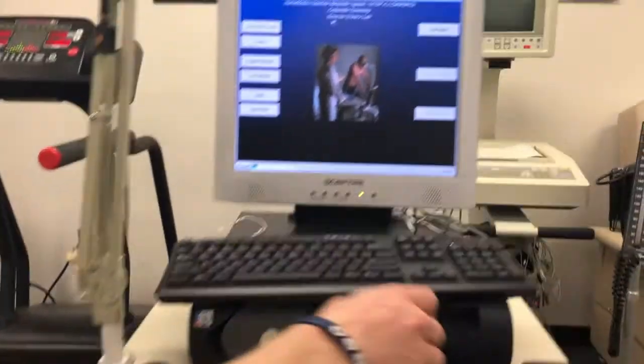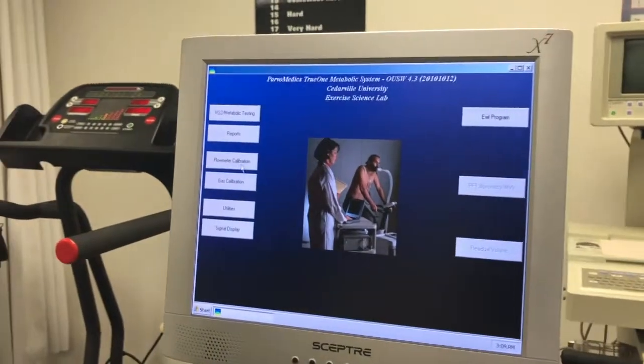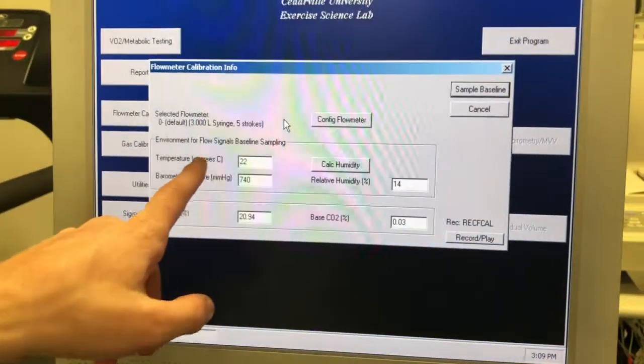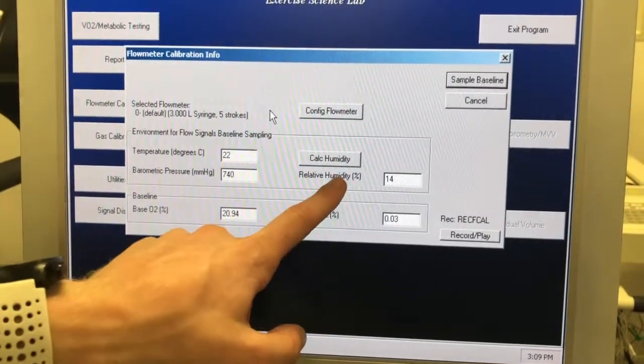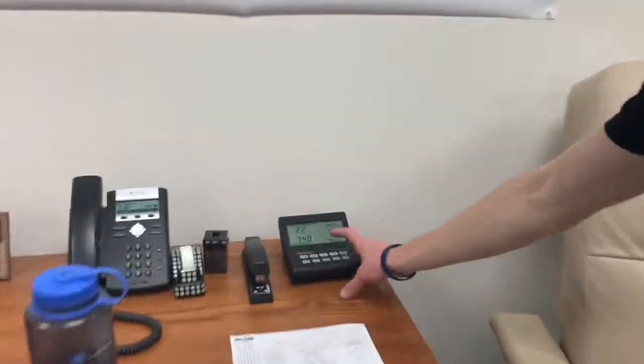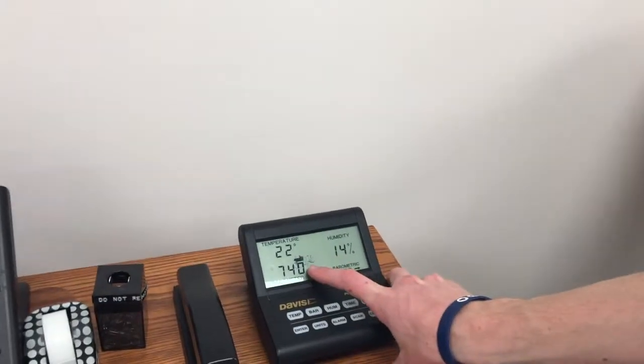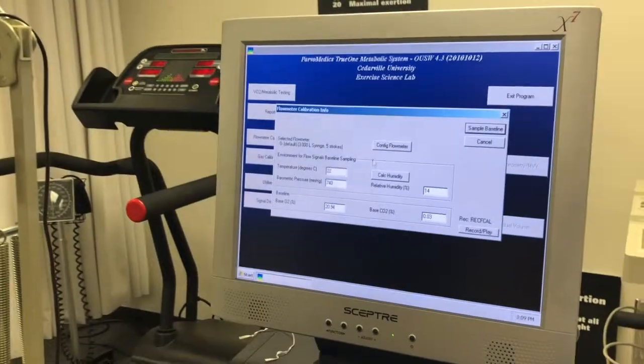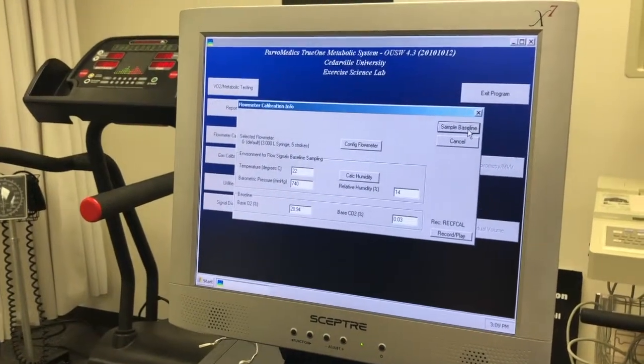On the computer you're going to hit flow meter calibration. Input the temperature, barometric pressure, and relative humidity from the black box right over here. So as we can see it's 22 degrees C, 740 barometric pressure, and 14 percent humidity. Those are entered correctly and we can go ahead and sample baseline.